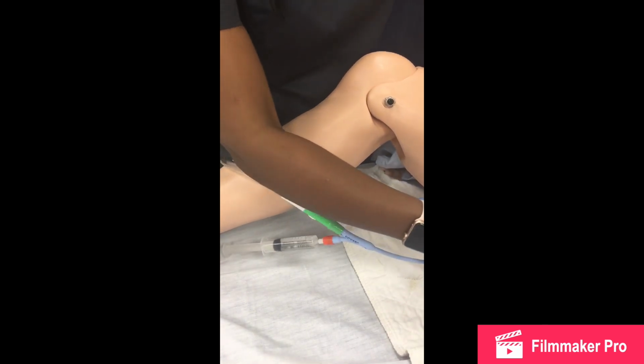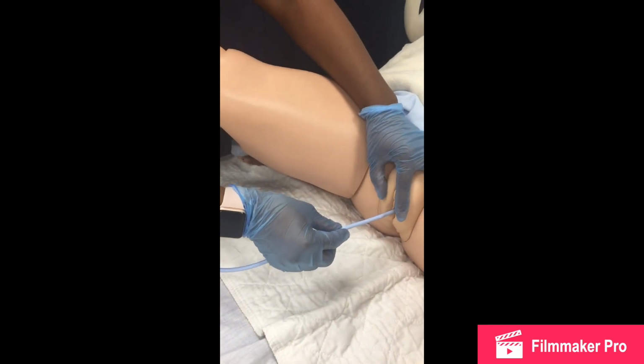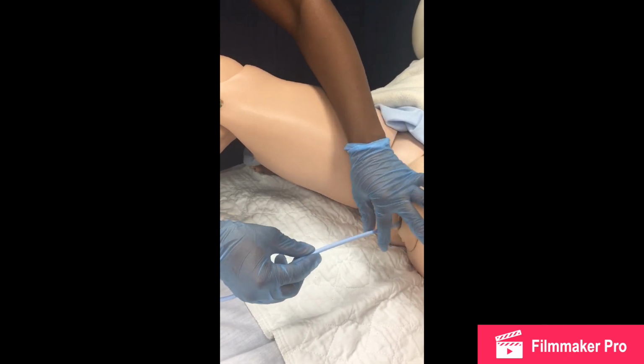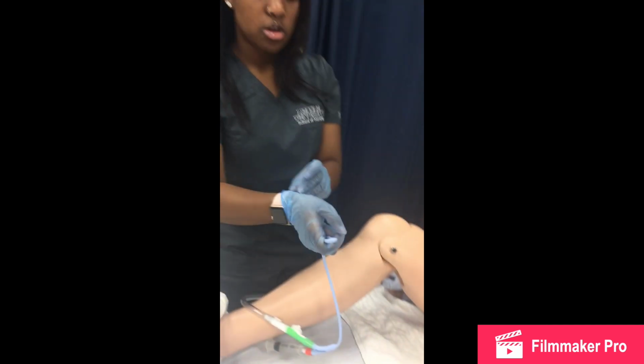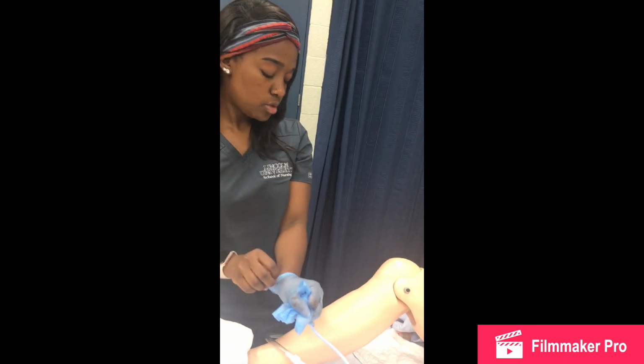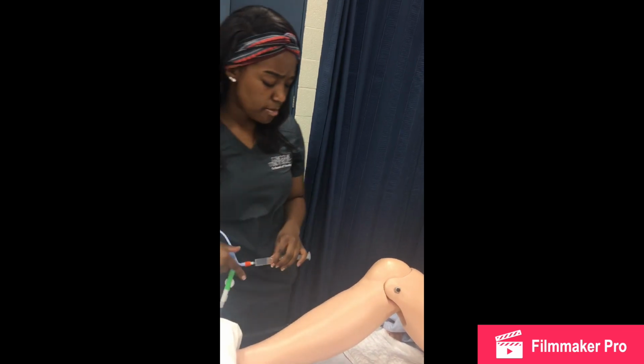Then I'm going to tell my patient 1, 2, 3, and exhale, pulling it out. And wrap the catheter in my glove. And at this point, I would throw this away. I would document that 10 milliliters came out, and I would document how much urine was in the bag. Thank you.